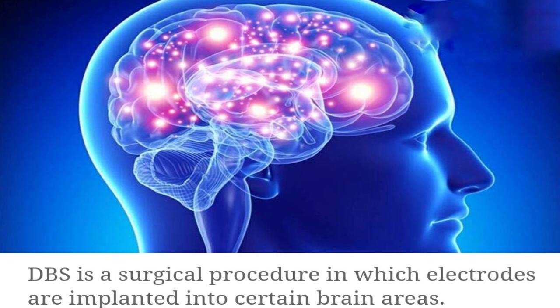During the treatment, UCSF physicians customized a new DBS device which would stimulate the brain whenever it recognized the depressive pattern. Additionally, the team of physicians also found a neural biomarker that indicated the onset of symptoms. Using the customized DBS device, they are able to stimulate a different area of the brain, which in turn created immediate therapy for the brain.